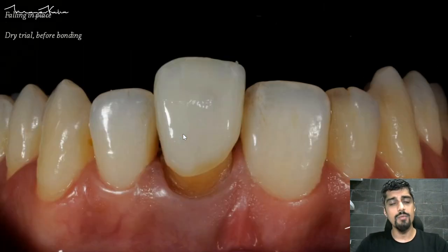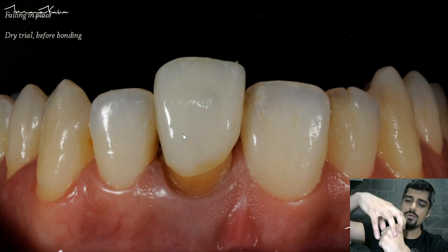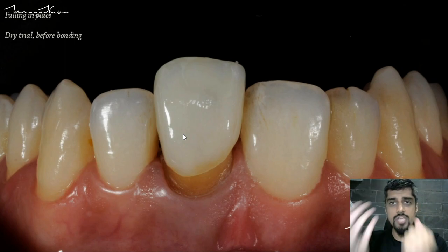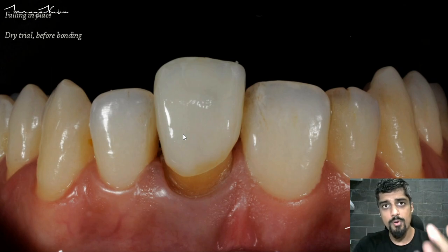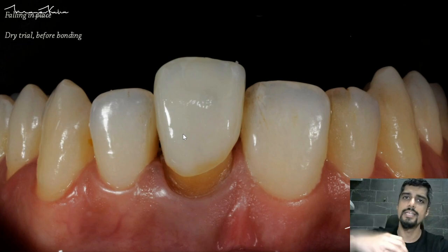It comes back and we do again a trial — this is called a dry trial — where we are just checking the fitting of the crown on the abutment. There is no gel, no trial paste — it is just the crown going inside, and we're checking for the proximal fit, meaning we're checking the contact points and the fit of the crown on the abutment teeth.